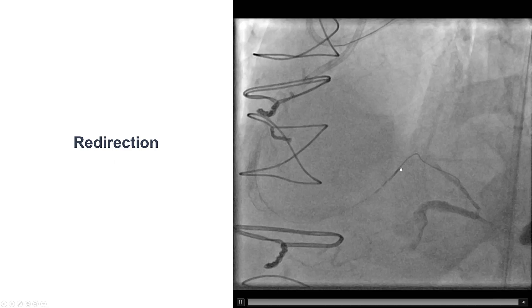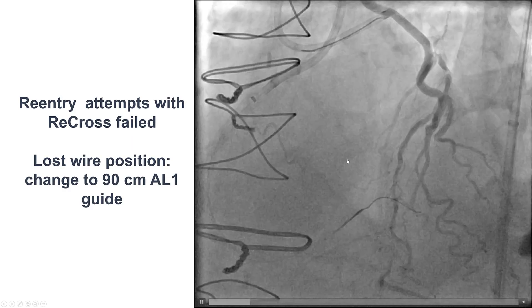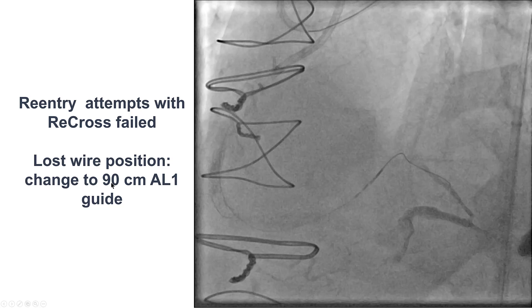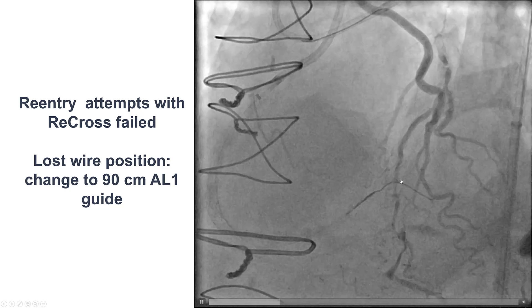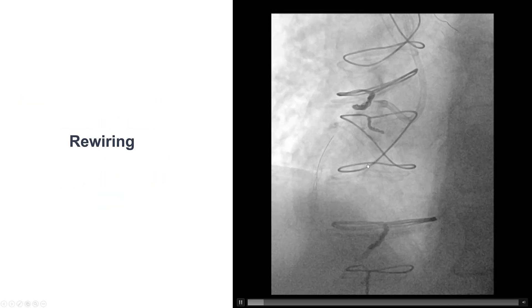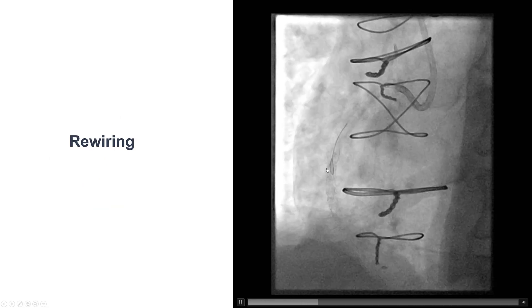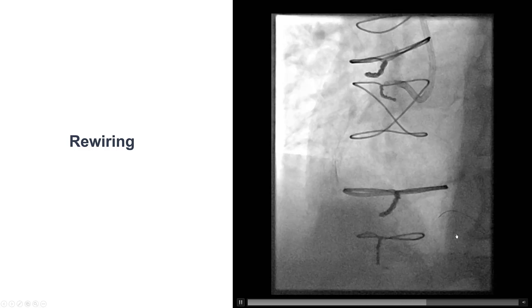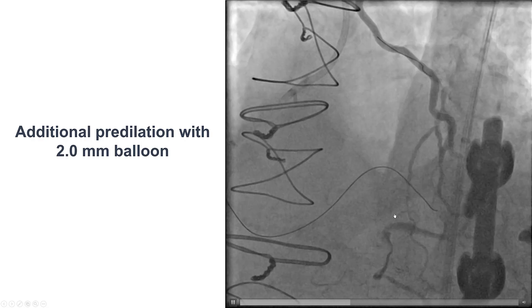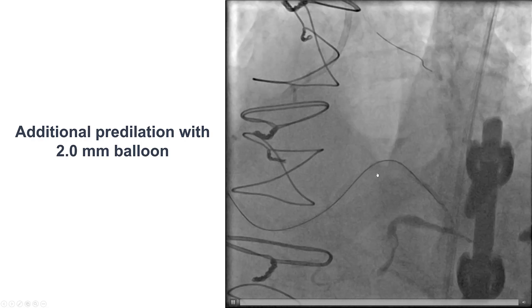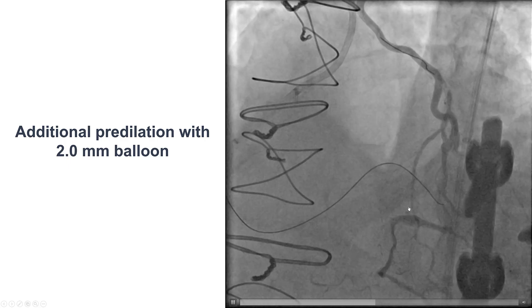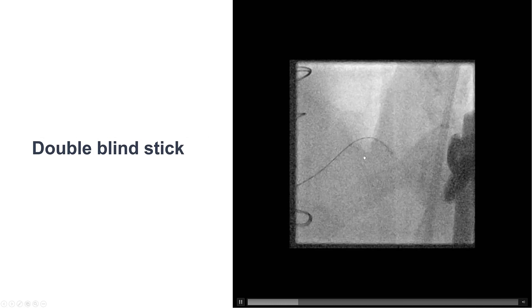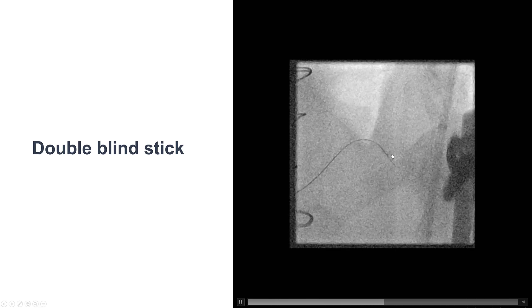We redirected the Gladius Mongo into the posterior lateral and tried re-entry, but then lost everything and had to remove the guide. This was a good opportunity to change to a 90 centimeter AL1 guide catheter that helped us reach that portion of the coronary artery. We rewired, and advancing a knuckle guide wire was fairly quick given prior ballooning. We had a lot of difficulty again delivering a Stingray balloon, trying several times, but eventually delivered a new one — the third Stingray balloon — to the re-entry zone in the right posterior lateral.